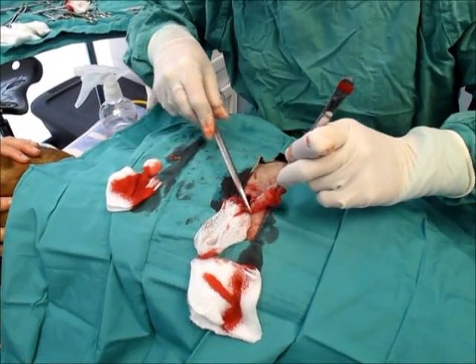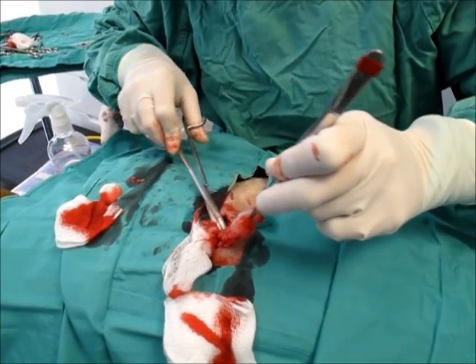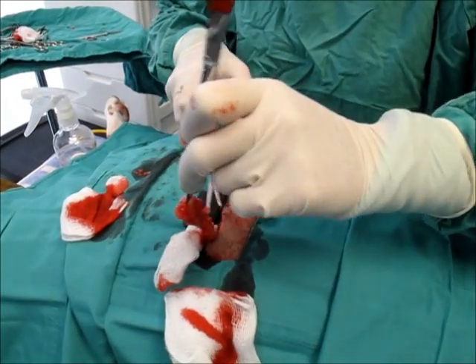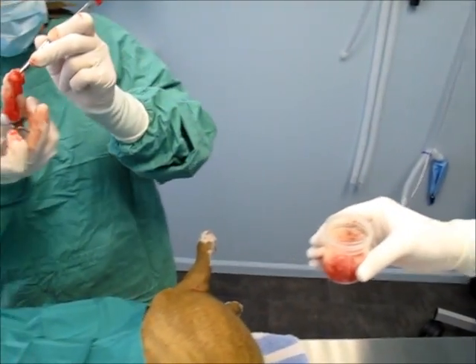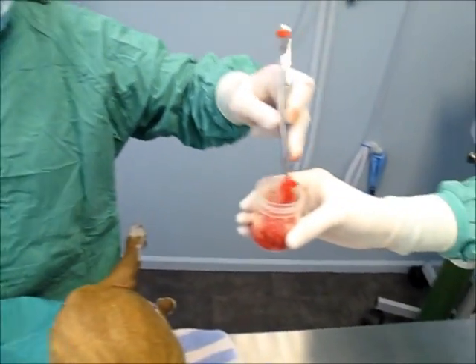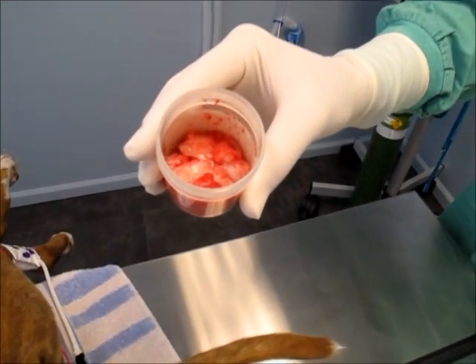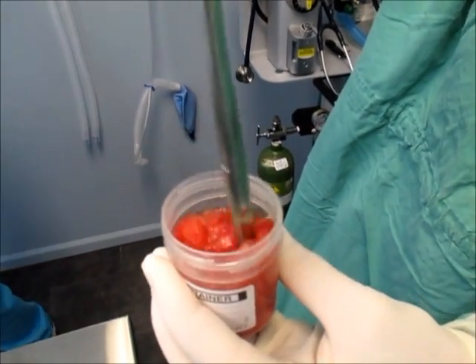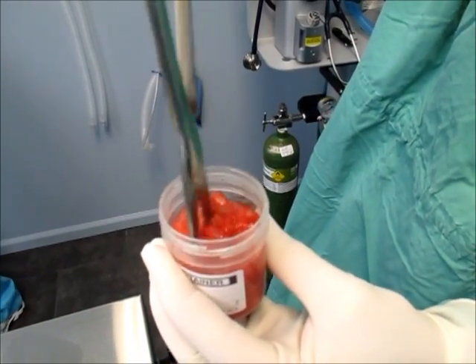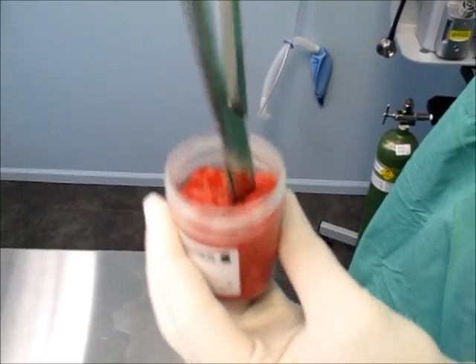We've extracted a chunk of fat. We've collected 40 grams of fat tissue and now we're starting the mincing process. I'm just cutting up the fat tissue so that we can get access to the stem cells.